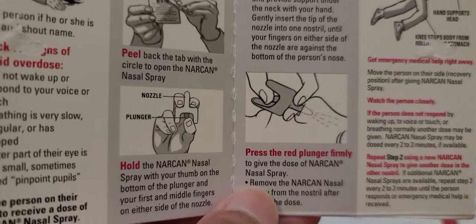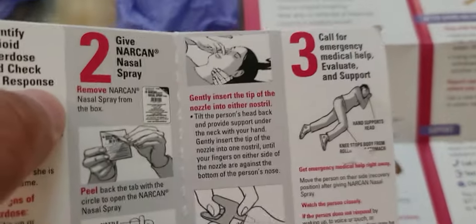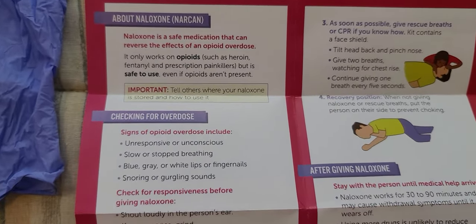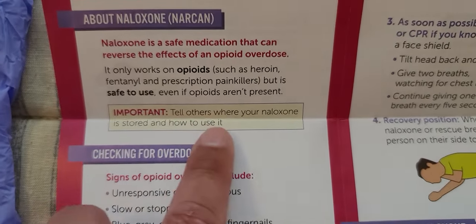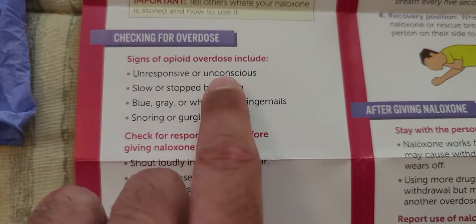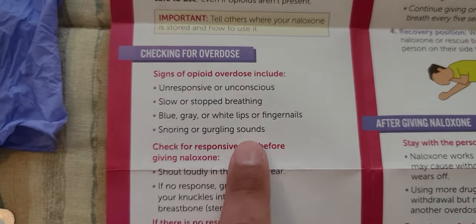Press the red plunger firmly. Then it says call for emergency medical help, evaluate and support. You have to do this quickly — that's very important. There are steps on the card and it says: tell others where your Naloxone is stored and how to use it.